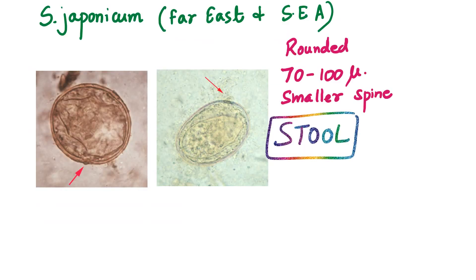Schistosoma japonicum is mainly reported from Far Eastern and Southeast Asian countries — China, Vietnam, Philippines, etc. — though it is now almost eliminated from Japan itself. The eggs are in stool, rounded or subspherical or oval, 70 to 100 microns in size, with a small spine that is relatively smaller than those of haematobium or mansoni.